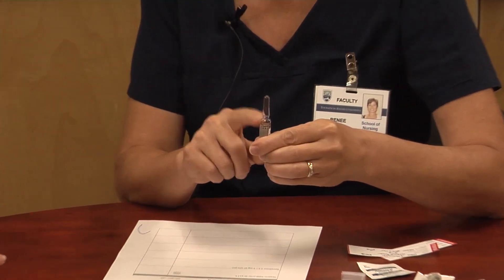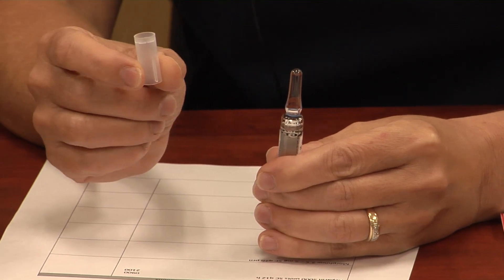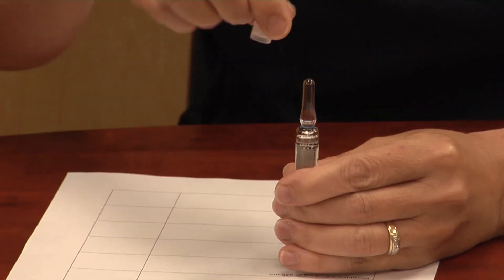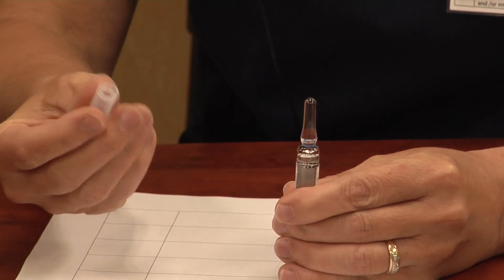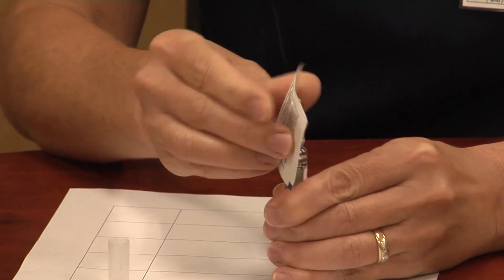We're going to prepare a medication from an ampoule. An ampoule is a glass container that holds one dose of medication only. There are a couple of safety things you have to think about because you have to break this glass. There are ampoule breakers — little plastic tubes that fit over the top. If you don't have that, you can protect yourself with an alcohol swab wrapped around the neck to break it.